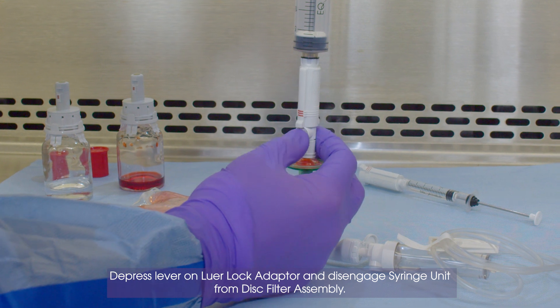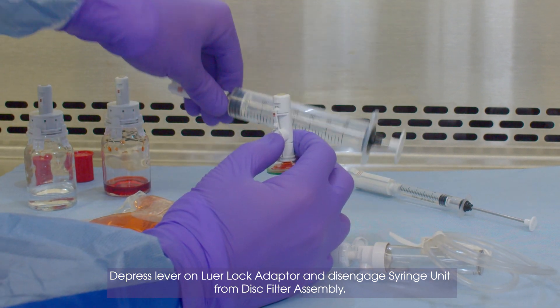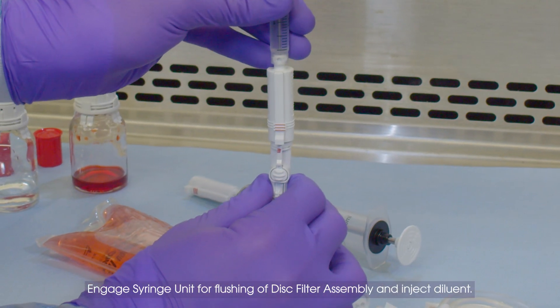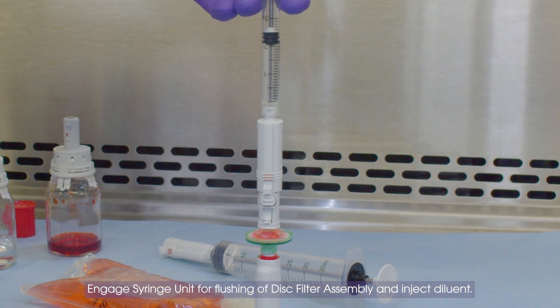Depress Lever on Luer Lock Adapter and Disengage Syringe Unit from Disk Filter Assembly. Engage Syringe Unit for Flushing of Disk Filter Assembly and Inject Diluent.